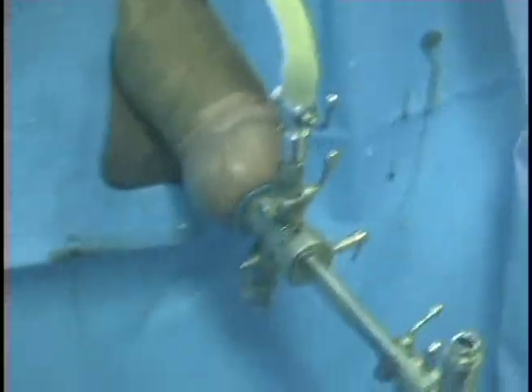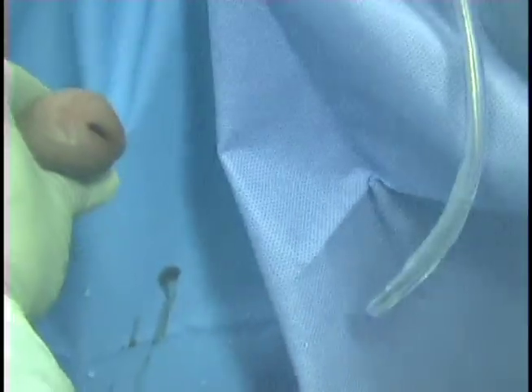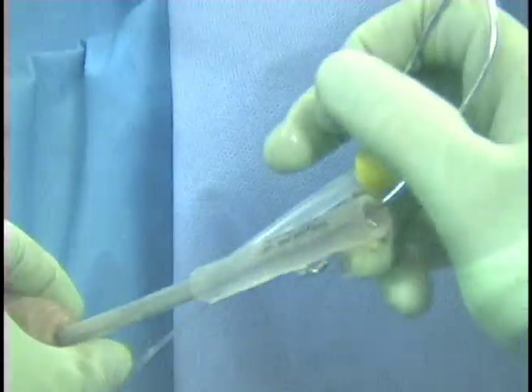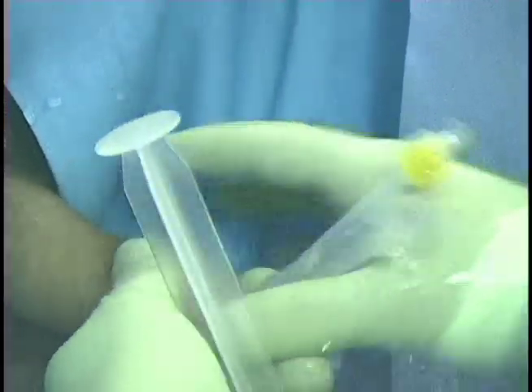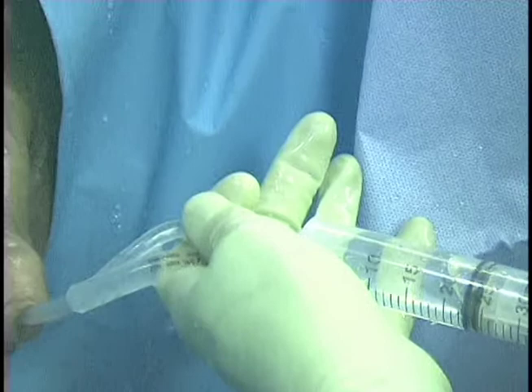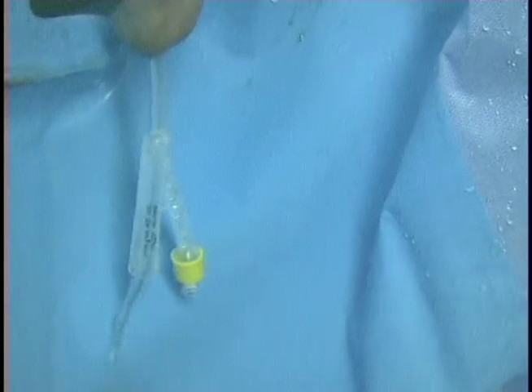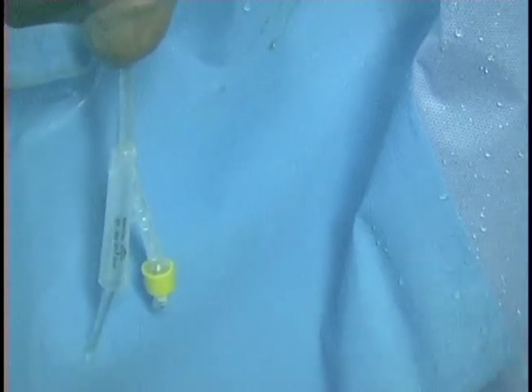So as such, during this phase, we have overfilled the bladder with continuous irrigation in and closed off the outflow valve. We will then slip out the 23 French resectoscope sheath gently and immediately place in a 20 French Foley catheter over a stylet with 30 cc's in the balloon. The very small detail of overfilling the bladder serves many purposes, including hydrostatic pressure for hemostasis, and upon placement of the catheter, we are 100% sure we're in the bladder simply by the clear jet of the pressure of that water in the bladder. So as such, for surgeons, it eliminates the question whether or not we're retrotrigonal. It's a nice, simple way to get better hemostasis and not waste time by needing to re-irrigate the bladder.